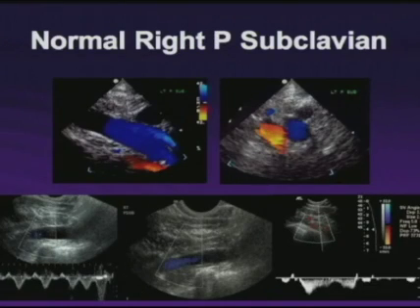Peripherally, the subclavian vein can be seen quite well in both long and short axis, as identified by the color images above, and we can see the normal spectral Doppler tracings in the peripheral subclavian vein, again showing relatively high velocity flow during part of the respiratory cycle, here on the left example, and on the right example showing diminution of the flow velocity, also related to respiratory change.